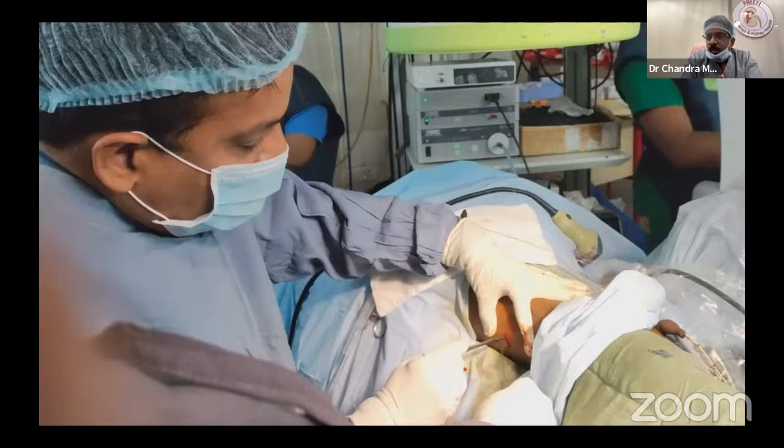Even in mini perc, don't think about it. Either one stitch or no stitch will happen. It does not make any difference to the patient. So please do not dilate without cutting the dermis. There is no need to cut the rectus sheath because it is dangerous.